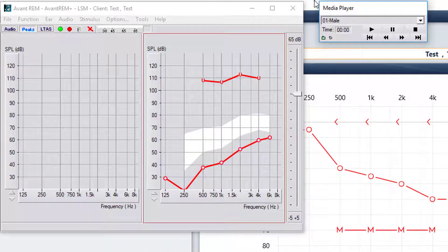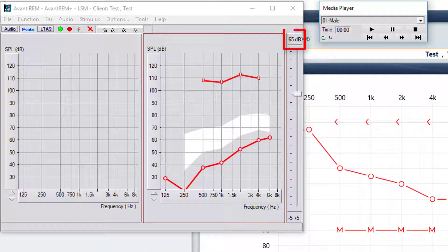So now that we have our file, we're going to pick our target. The default is 65, which is your average conversational speech.